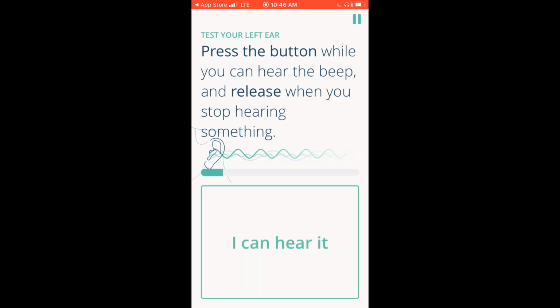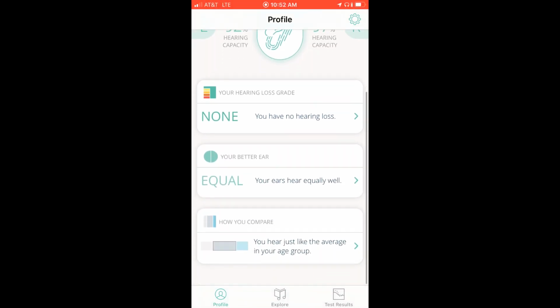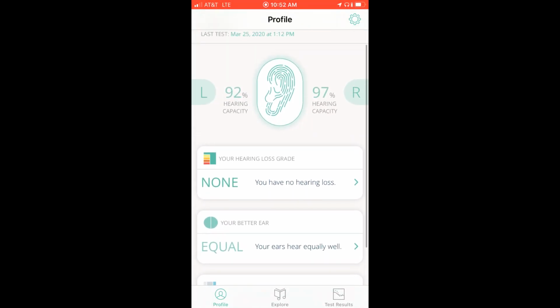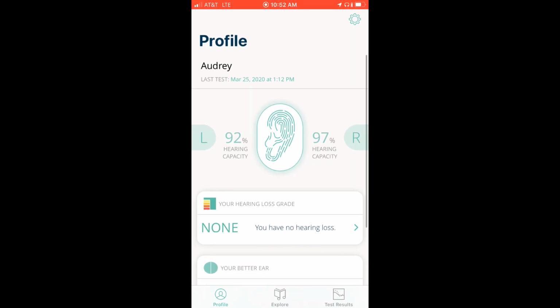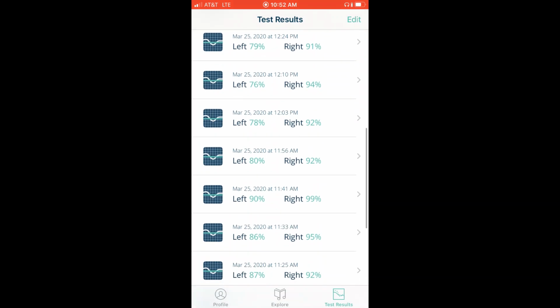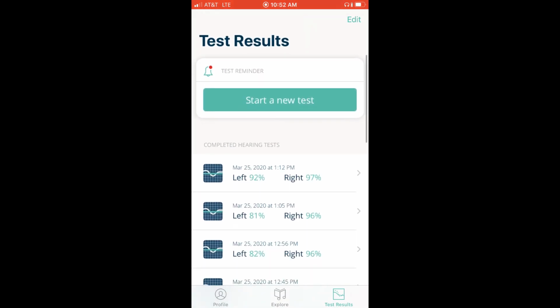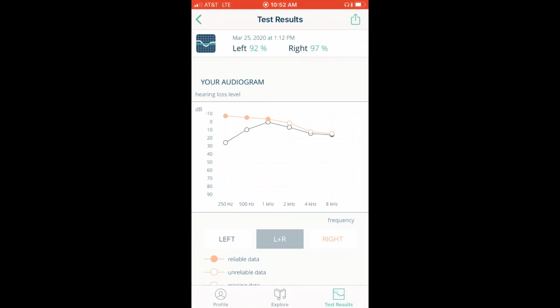It does take a little bit of time, but at the end, it's going to give you a profile of information. So it will tell you a little bit more info, but what we want is a true graph or an audiogram of your results. So in the bottom right corner, you'll click test results. You can see I've got a lot here, but under completed hearing tests, you'll click on that and you should get a graph like so.